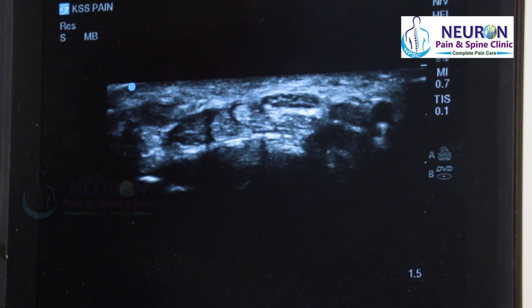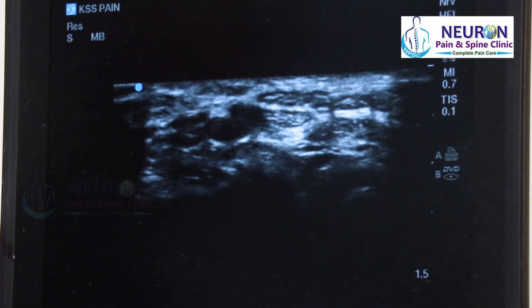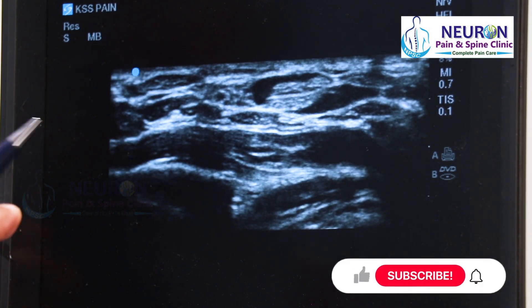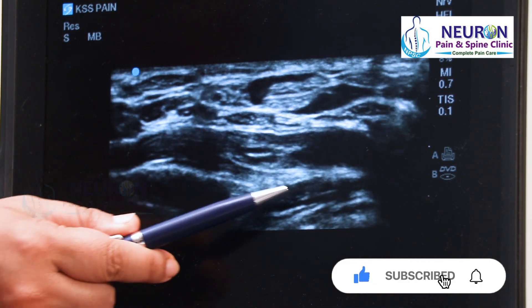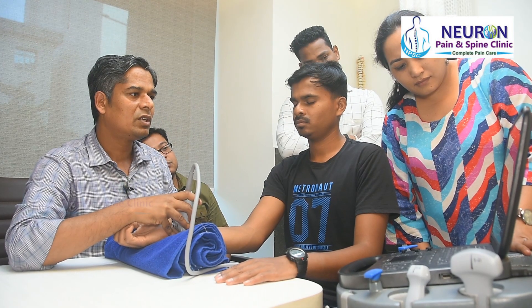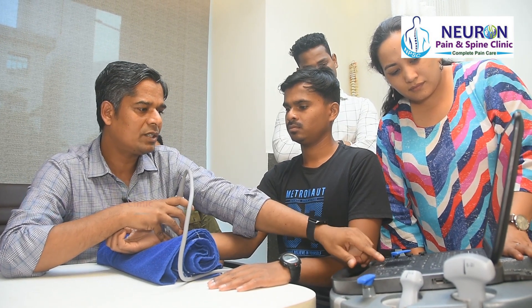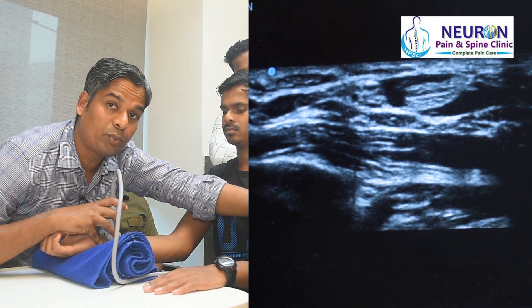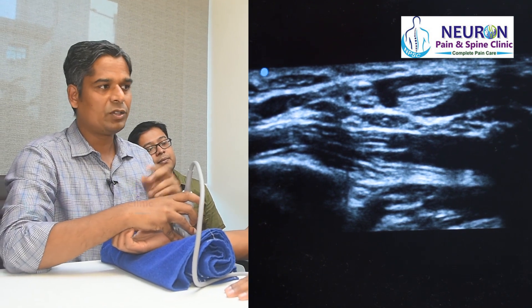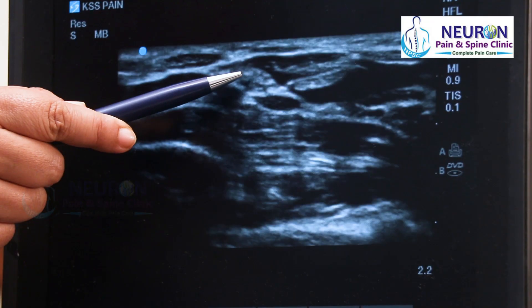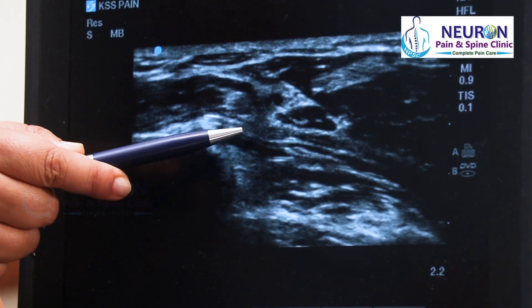Have a look at that nerve. As I slowly go up, the nerve is coming down. A small muscle appeared — that muscle is your pronator quadratus. In carpal tunnel syndrome, we also measure the cross-sectional area of the nerve at the pronator quadratus level, proximal pronator quadratus, and see the difference from distal to proximal. You can see the pronator quadratus deep there.